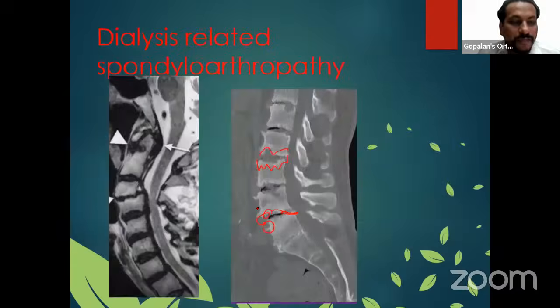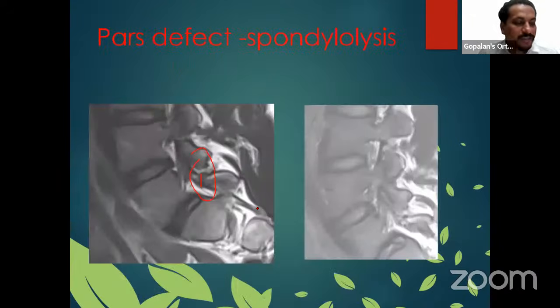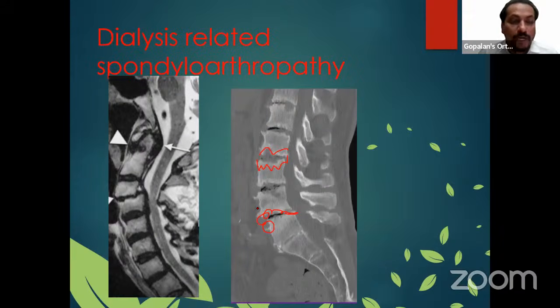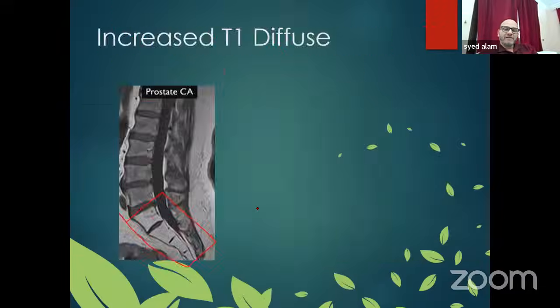Syed, can you take us to the previous slide? Yeah, I see. I just want to read out a question on the cervical spine. Someone wants to know, how does cervical spine myelomalacia appear? That's in our YouTube chat box. So you can just mention it on this. Oh, no, I will show. I have one myelomalacia.